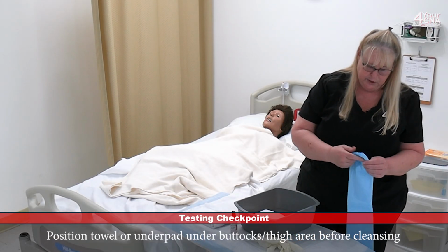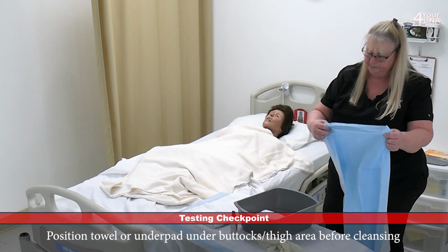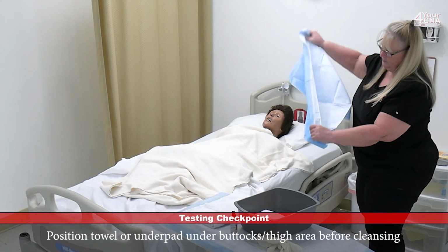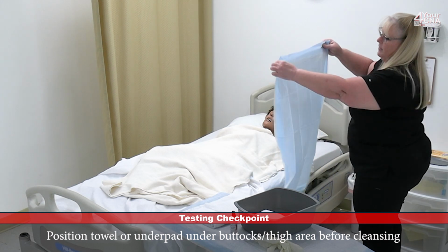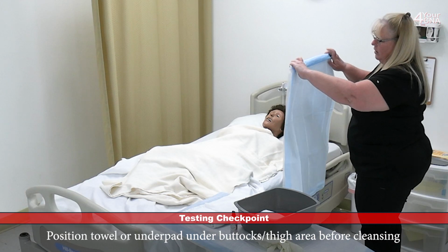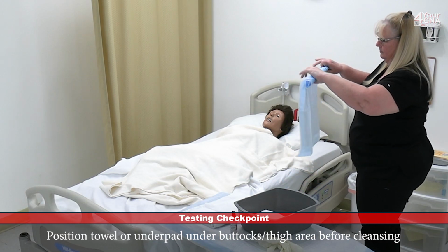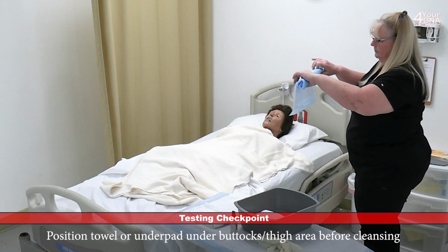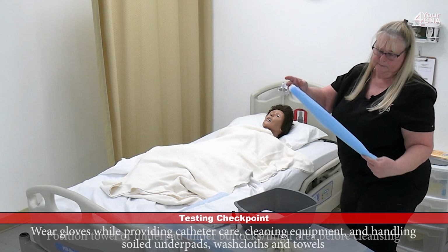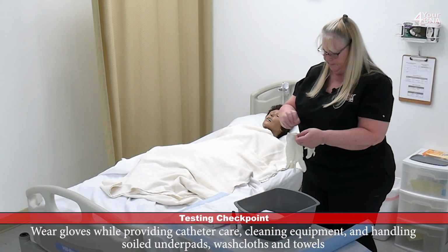And I'm going to prepare the underpad to go under the patient. I'll open it up. I'm going to hold it up lengthwise with the absorbent side facing me, and I'll roll it all the way to the end. Now I can put my gloves on.